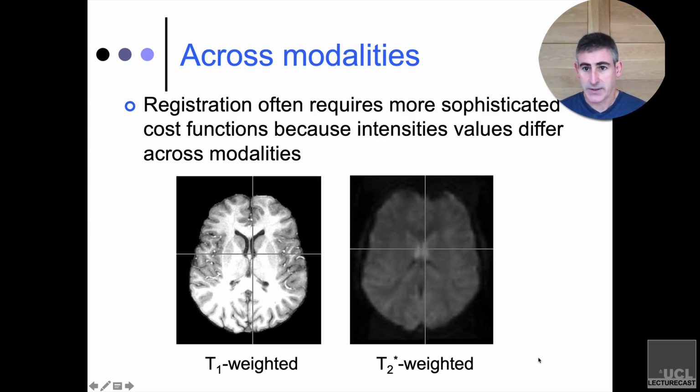So just doing a sum squared error when you're trying to relate images from different modalities, like a structural and a functional or something along those lines, doesn't work anymore. So it's perfectly fine when you're doing motion correction, realignment, right? Because those are all images in the same modality. They're all functional scans by definition. And therefore, any given voxel's intensity doesn't change over time. I mean, if it's gray matter, it gives you a particular value. If it's white matter, it gives you a different value. But it doesn't change from image to image. That's not true if you're trying to link images from different modalities, which is something that we definitely want to do in order to, say, overlay activation onto a person's anatomy.